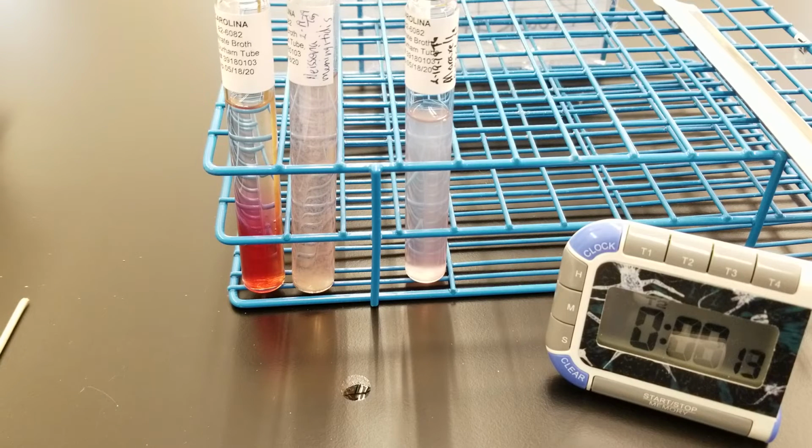So again, this would also be done on the GNR section. It's not just the GNCs, but it can be done on the gram-negative bacteria. This is not the nitrate reduction test you will be doing with the anaerobes, the obligate anaerobes, the last section of our course. We have a disc for that.